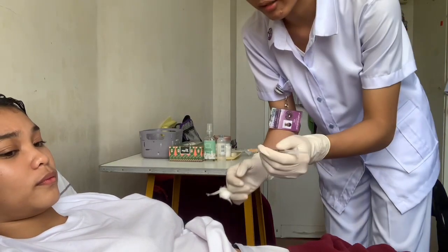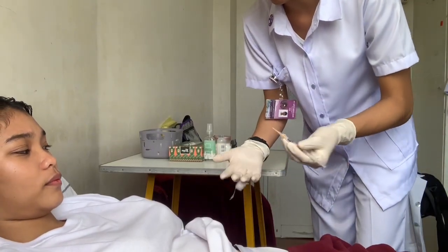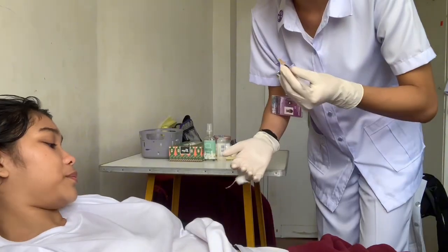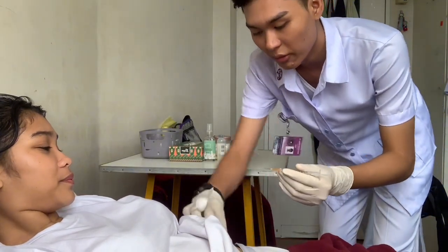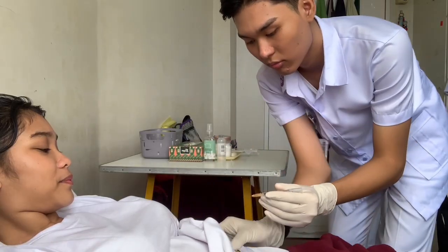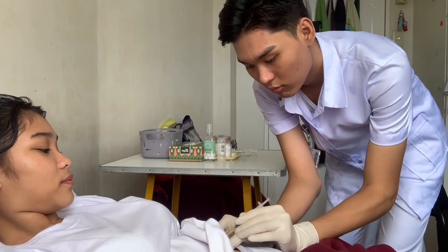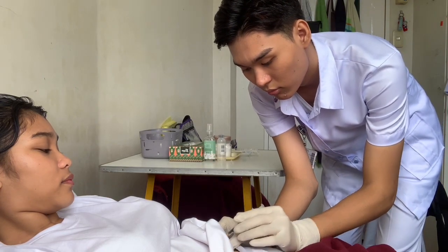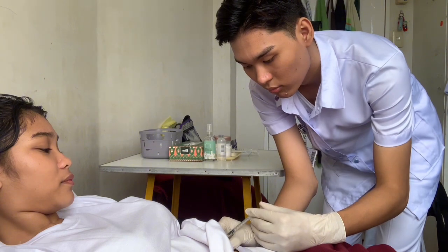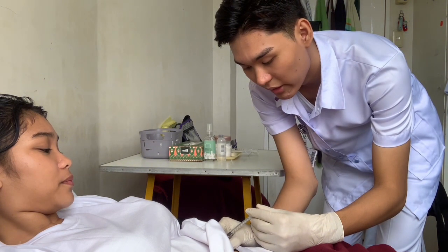So now imagine that you're holding a dart. So what we are going to do is to insert the needle for about a 45-degree angle insertion. Release the medication.